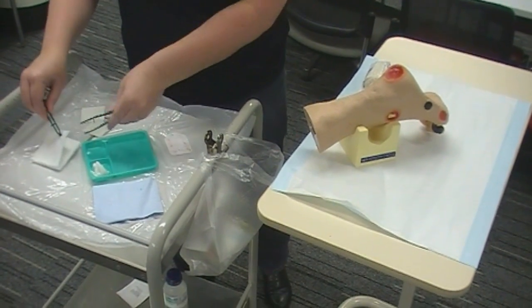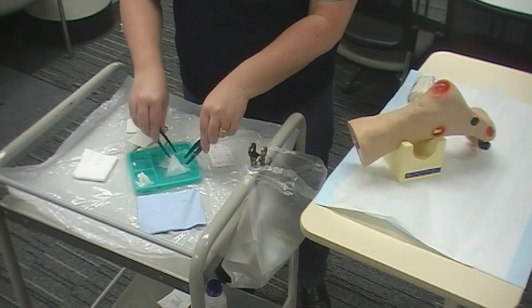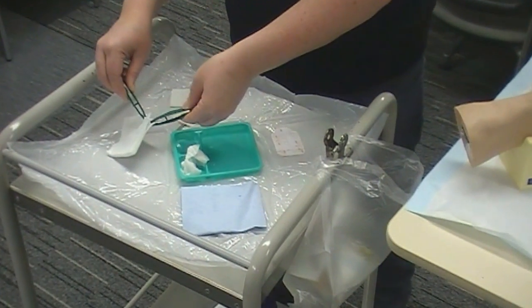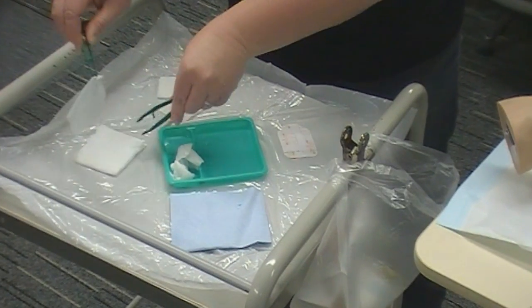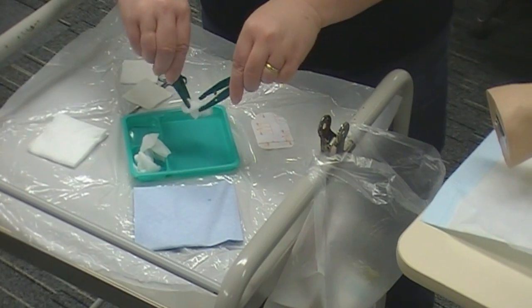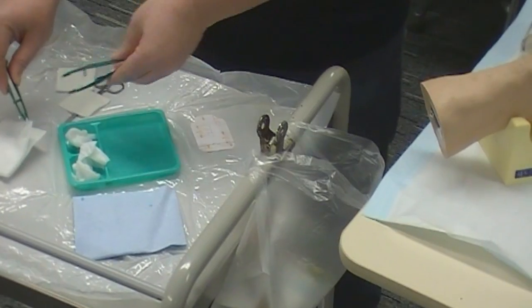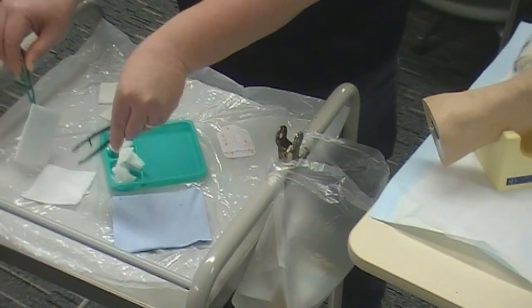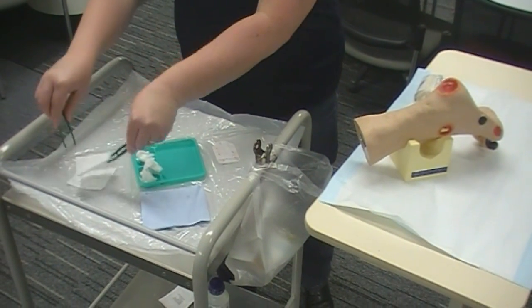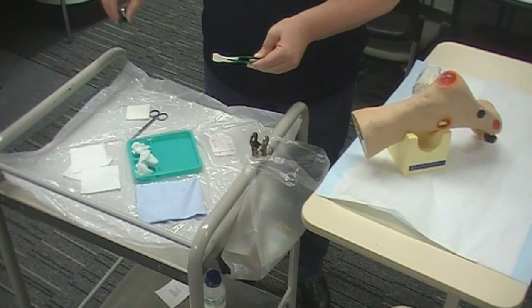Wet as many gauze swabs as you feel you're going to need to clean the wound — this might be all of them and you may need extra as part of your setup process. While I'm doing this I'm also going to have a look at the wound. We use the TIME framework for wound assessment, and the big things we're looking for are the amount of exudate, the amount of time the wound has been there, the size — in many cases you'll need to measure your wound — and also the colour of that wound.